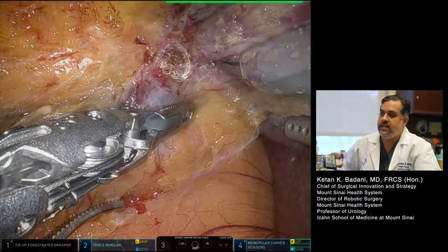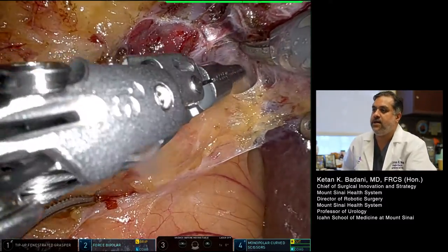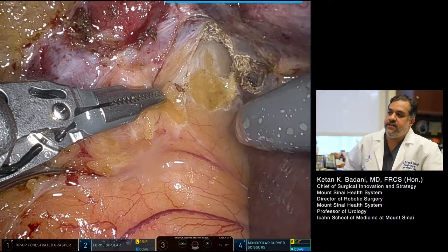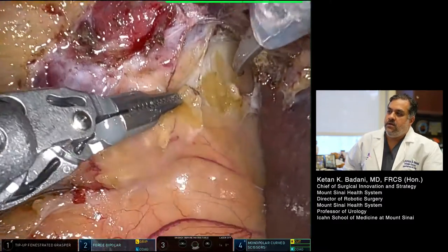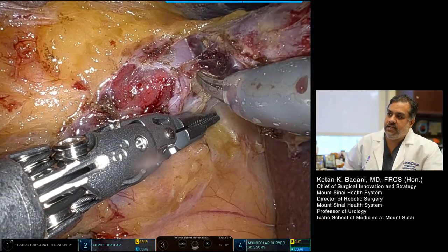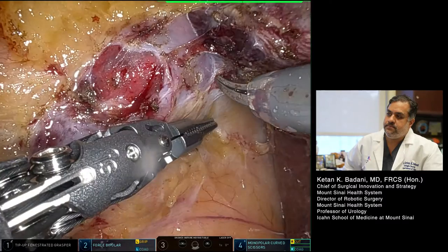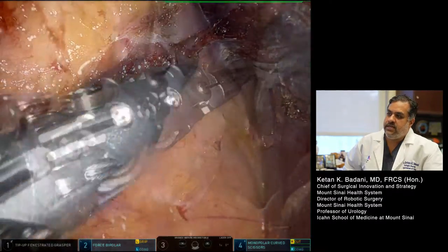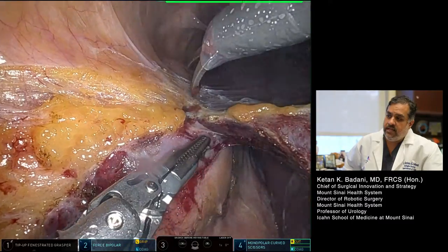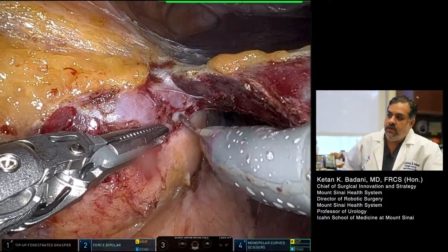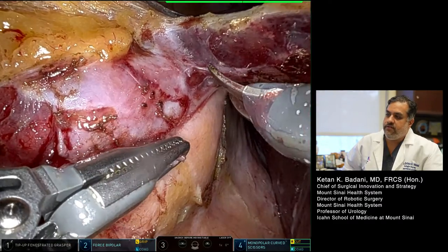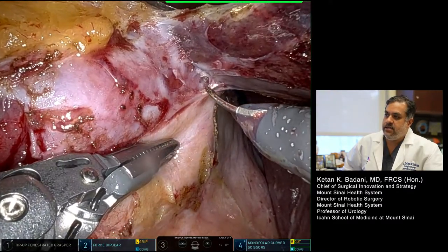I've gone into the capsule of the kidney a bit — you can see it decapsulized on the top there, but not where the tumor is. The tumor is fully endophytic so it's not going to be sticking out. I need access to the hilum; I need to be able to clamp this kidney given the endophytic nature of the tumor. We really do have to reflect the kidney off the liver here. At the end you'll see that as bad as this adhesion was, the liver looks pretty good, the kidney looks pretty good, and we're able to accomplish our goal.